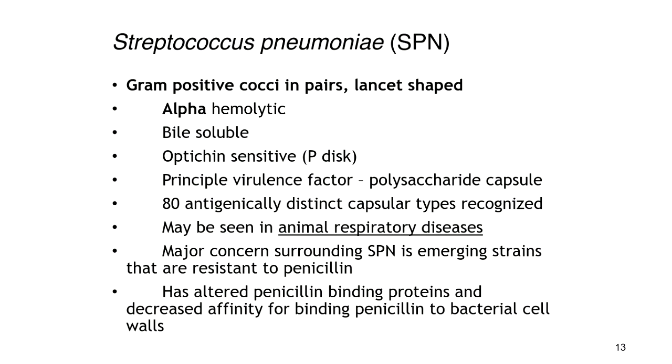And respiratory diseases. So again, where did the sample come from that you're sending to the lab? Is it from the oral cavity? Is it from a wound? Or is it from a deeper respiratory area or sputum or something on that order? That could help a diagnostic lab have a better idea what they may be looking at. And they may be more cautious about how the hemolysis pattern looks. Can we do a bile test and actually see if it's soluble or not?